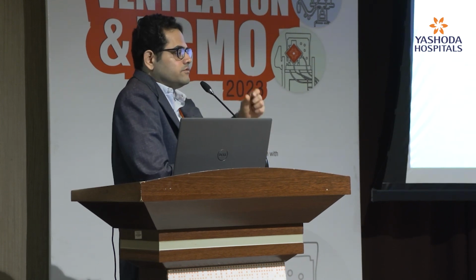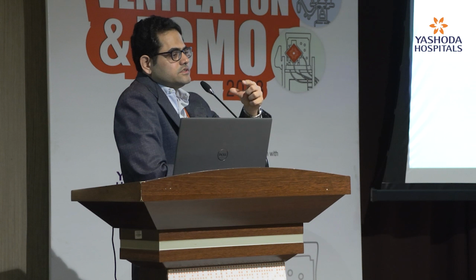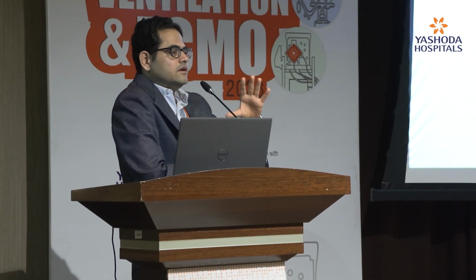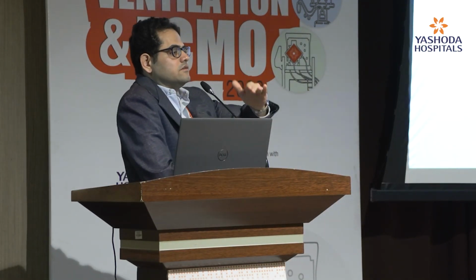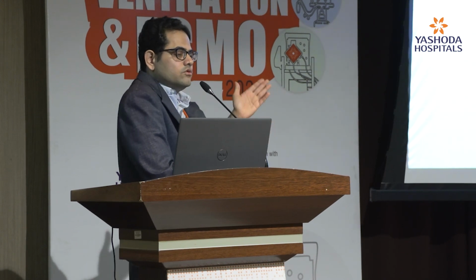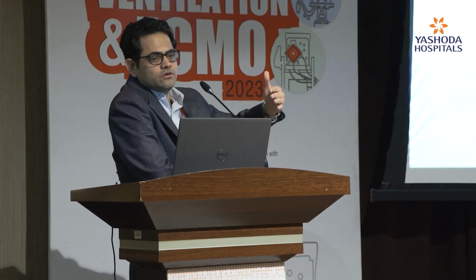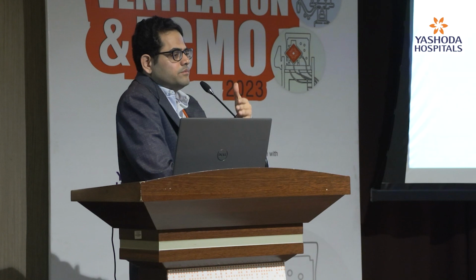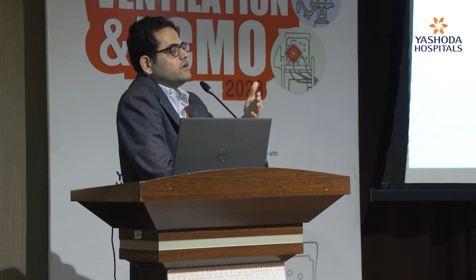Coming back to decreasing the I:E ratio. For COPD or obstructive airway disease, we keep the expiratory time more prolonged, so that washout of the carbon dioxide will happen. So all these hemodynamic changes seen previously may not happen here. It is easier to wash out the CO2. Auto-PEEP also will not be there. But the benefit we were getting previously, alveolar recruitment, will not be there.